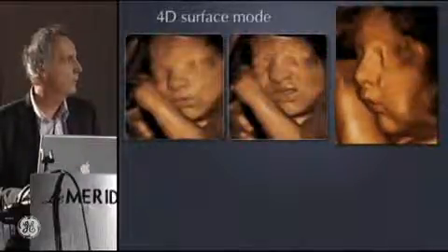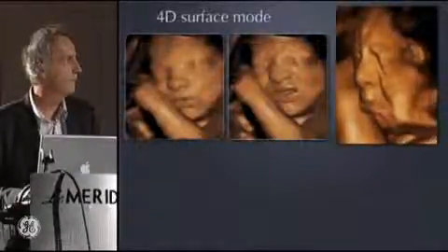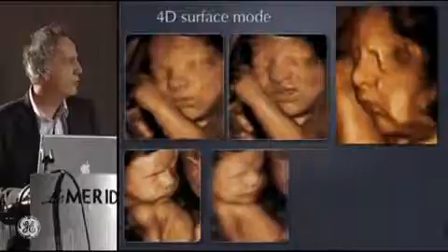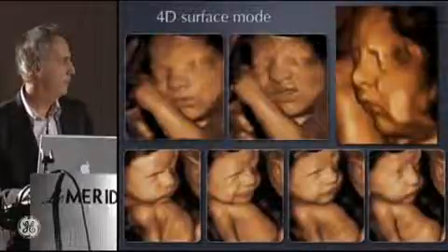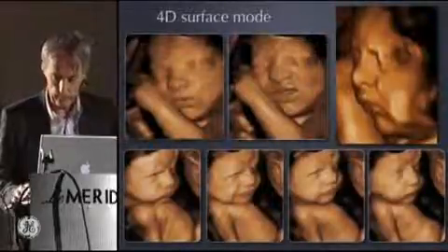And look at this one. I think it was a really sad fetus. You will cry. And some pictures extracted from a 4D sequence, and you can see between the pictures you have less than 2 seconds, and you can see the different mimics.